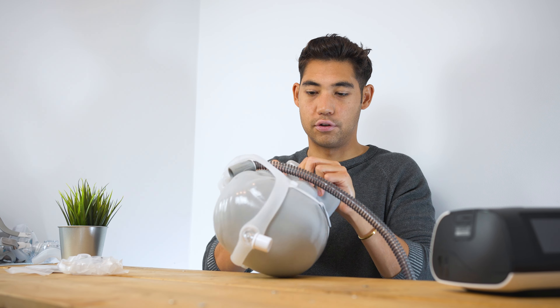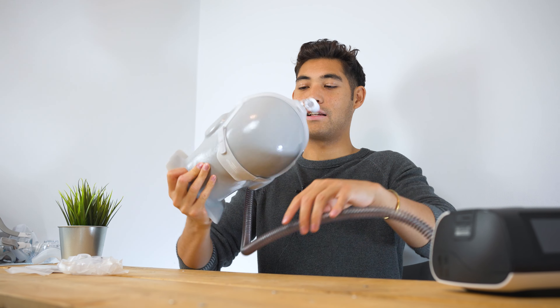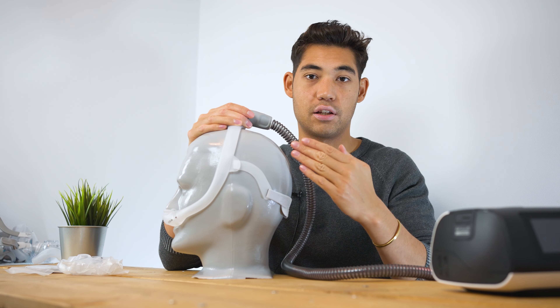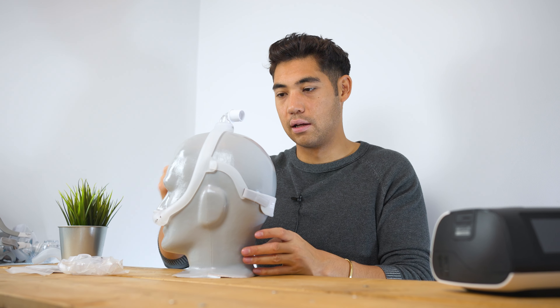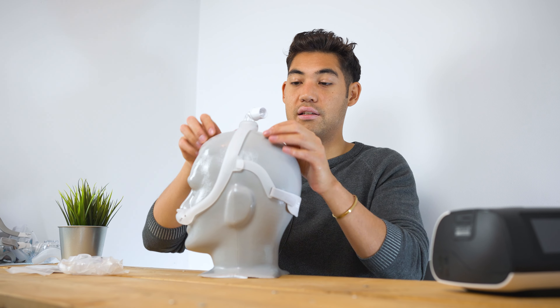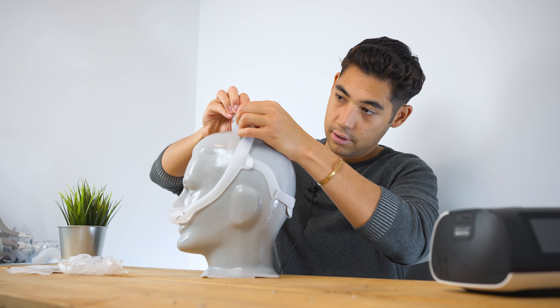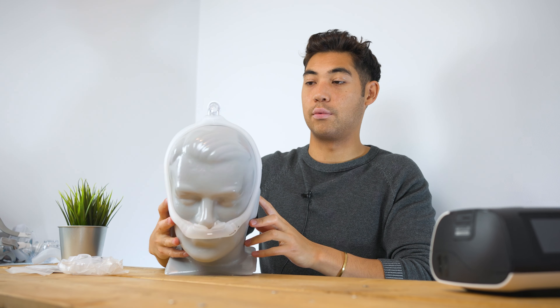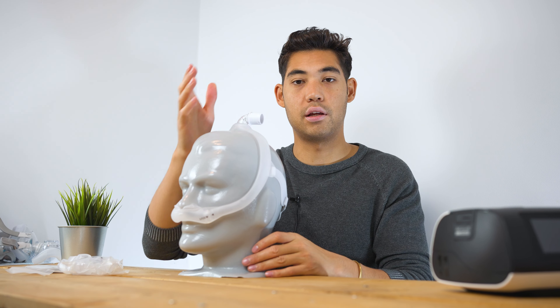We've got the heated line up to the elbow here. For those new to CPAP, you might look at this and think it's funny looking, because a lot of masks have the elbow at the front of the face. The reason why a lot of manufacturers have the elbow here and why people wear hollow frame masks is because it tangles a lot less. To demonstrate — this is you sleeping, having a time of your life — as you twist and turn, you can see the tube stays in the same place, which is pretty cool.